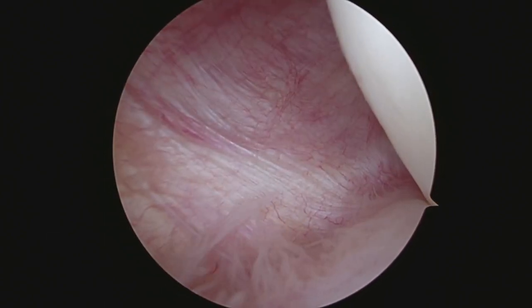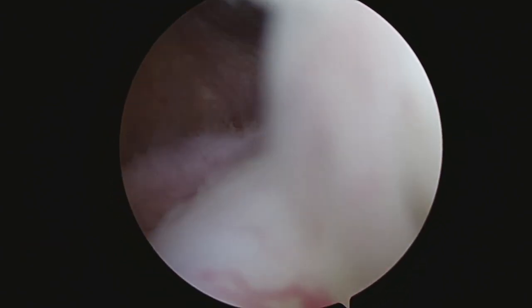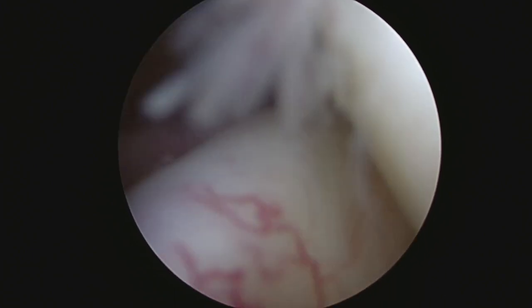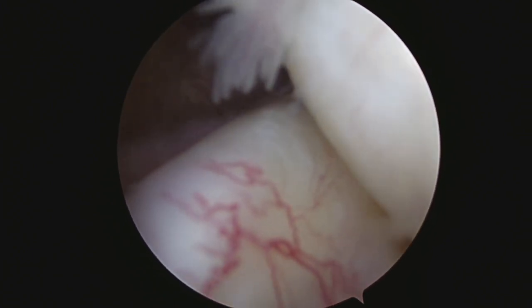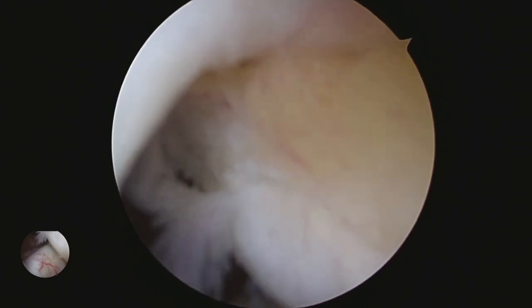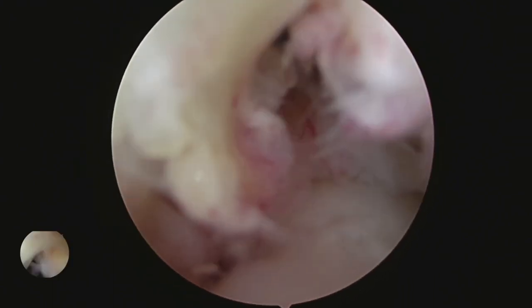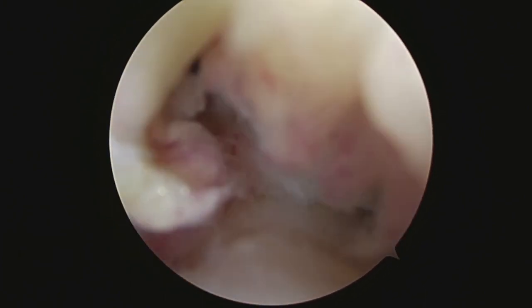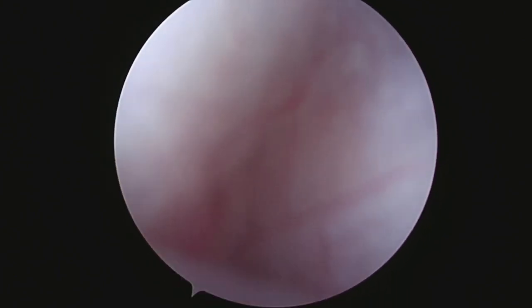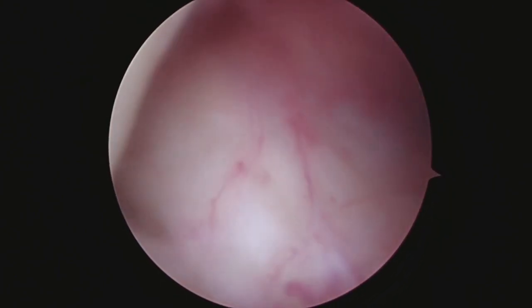Okay Roselle, we're in the posterior medial compartment of the knee. There are no loose chips or anything floating around there. I'm taking a look at your meniscus right there. From this view it looks reasonable, but this is where we expect it to start showing some signs of tearing. So I'll take a picture of that. That's your root - that looks fine. Your PCL is going to be right there. And your ACL is going to be right in the front here - you could see some of that tearing of that meniscus now as I'm coming back. And that's your ACL - all that looks fine.